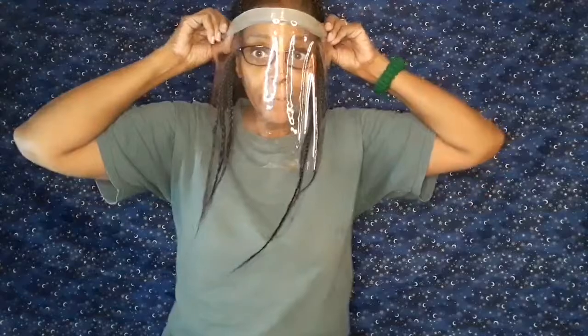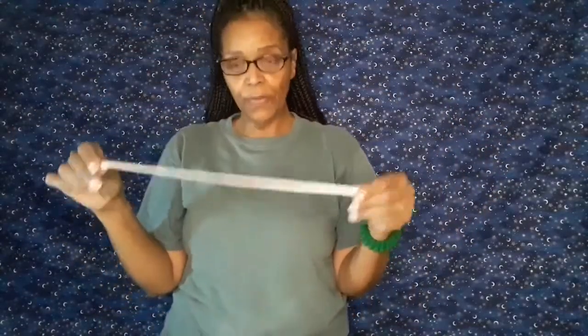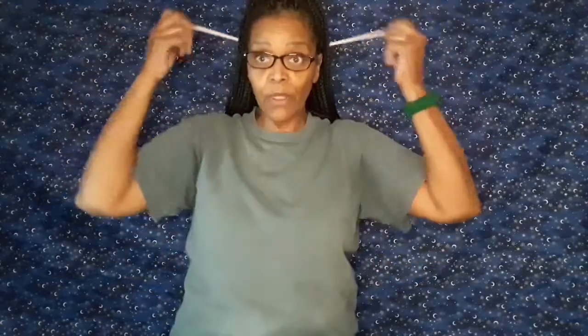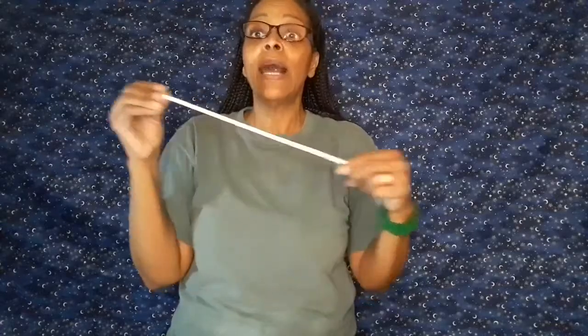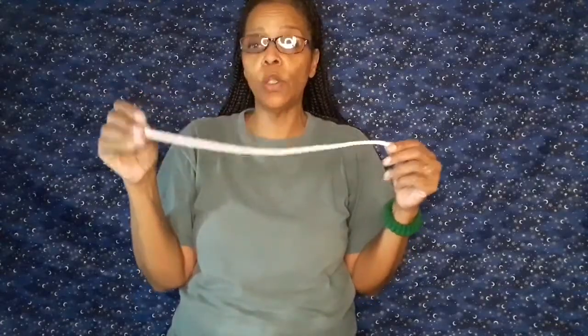The next step is I cut a piece of elastic, approximately 15 inches for me, because I want it to go around my head. And I've also used string. If I use a cording or a string or a binding or a ribbon, I cut 2 strips 15 inches long, and then once I've got it together, I cut it to tie in the back.